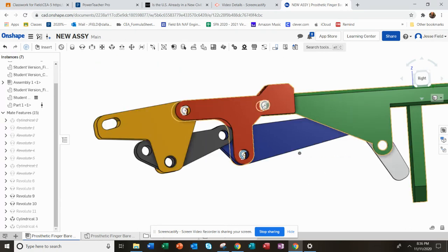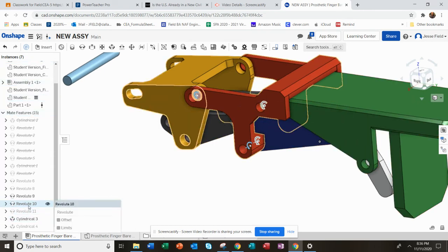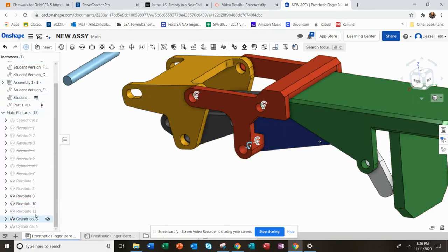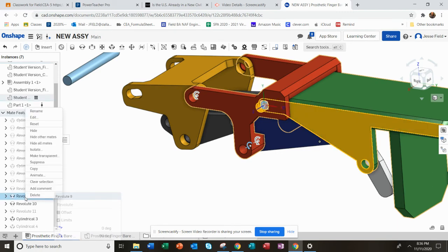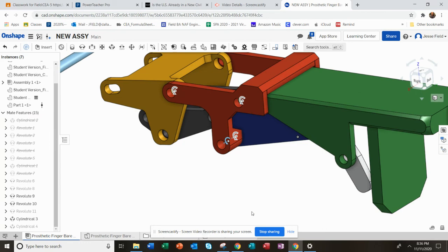It's actually going in the wrong direction there, I think. Now it's got the right action in there.